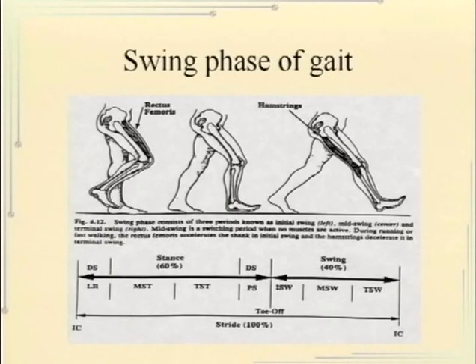And one of the things that we look at here is how far the individual can move that foot forward. So we're very interested in the step length, and whether it is too short or too long, and that gives us some idea of the balance of muscle activity between the rectus femoris and the hamstrings.